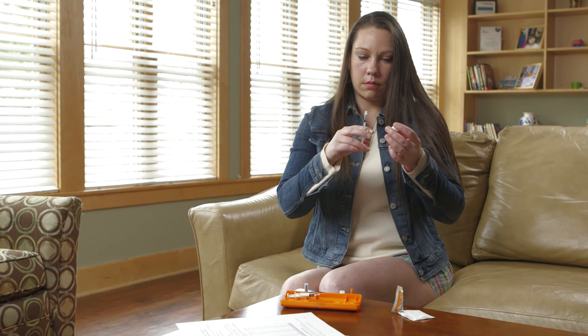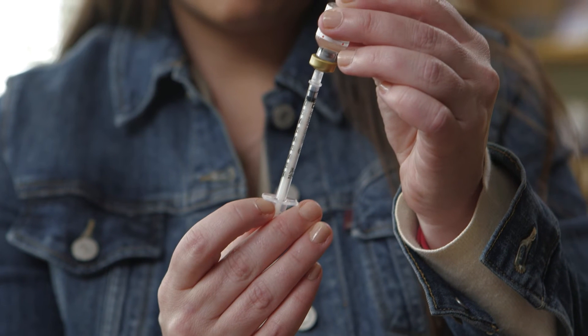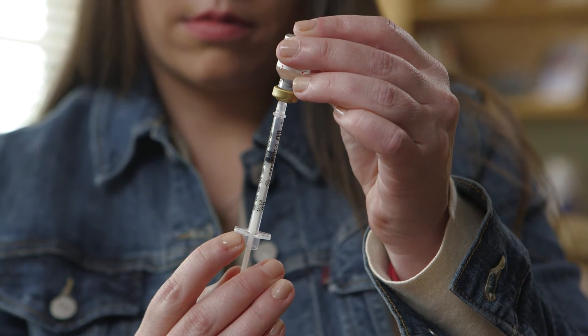Insert the insulin syringe into the vial. Flip the vial over. Next, pull the plunger on the insulin syringe back to the recommended dose.